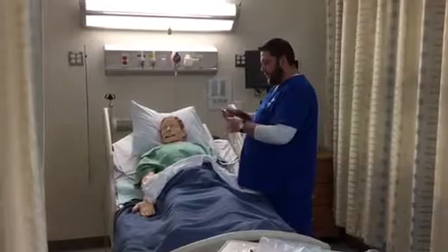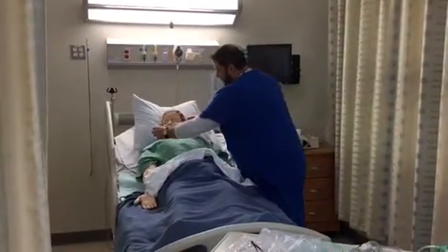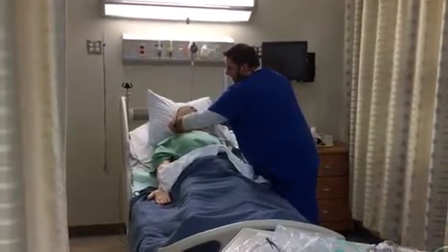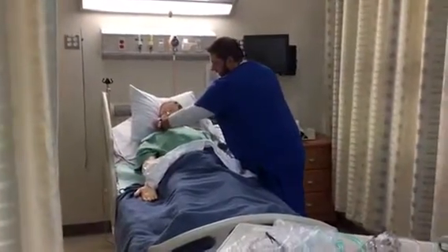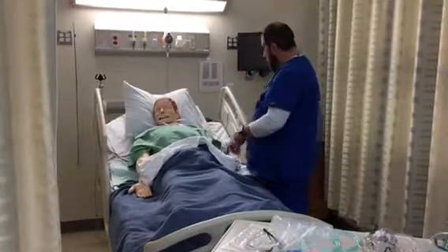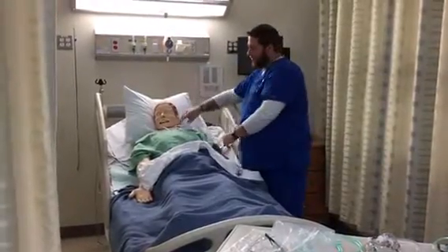Sir, you have the order. What we would do is insert into the nares, around the ears. This patient doesn't have ears. And once it's secured on the ears, we would adjust the strap. We would plug into the oxygen and set for the desired flow rate.